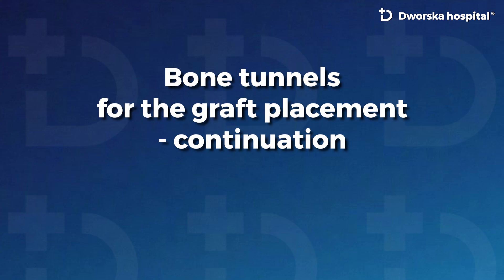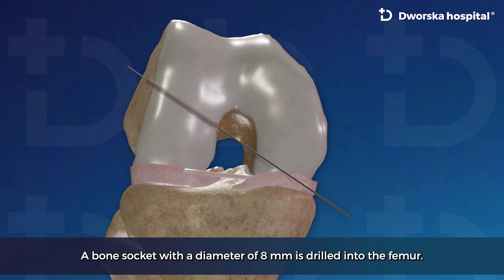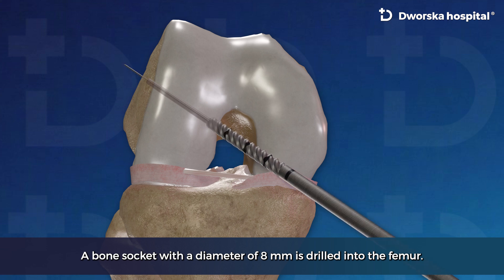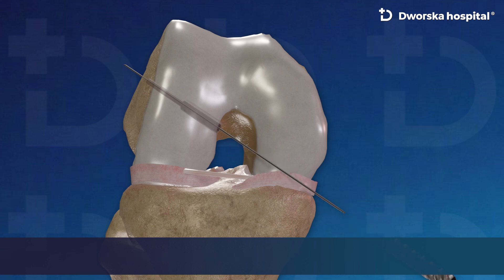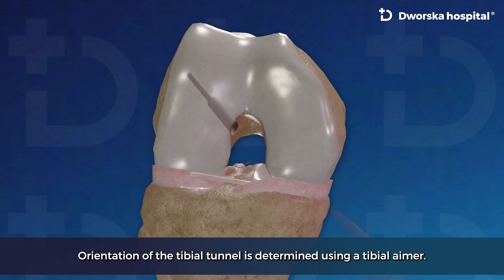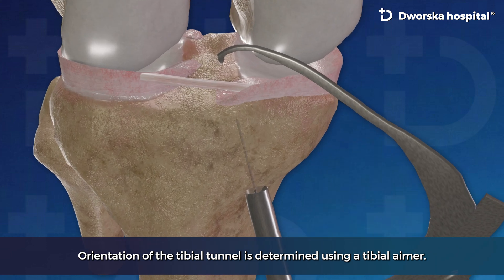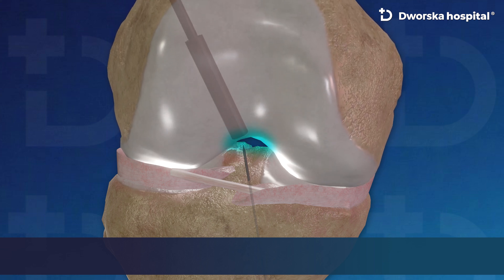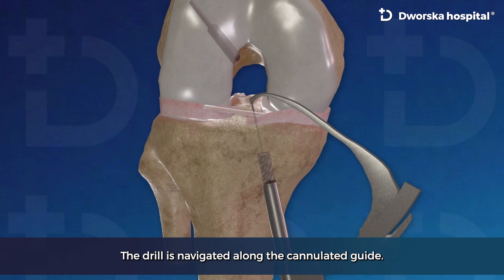Bone tunnels for graft placement. A bone socket with a diameter of 8 mm is drilled into the femur. Orientation of the tibial tunnel is determined using a tibial aimer. The drill is navigated along the cannulated guide.